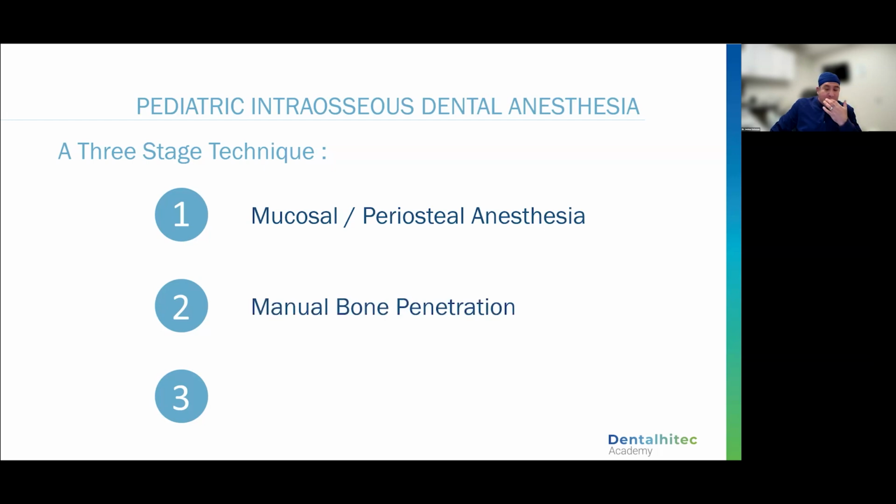Then the second phase, which is what people have to get used to at first. The first time we all gave local anesthesia in dental school, you remember, to an orange, that first pop through the orange was a little dicey for some people, right? I distinctly remember that day in dental school. Trust me, you do it a few times, you'll get used to it. And it's actually now a comforting fact. You're not always going to feel that pop. We'll talk about that later today. But knowing that you pass through that cortical plate, you can feel it. You know that you're most likely into the correct area. And then we're going to give our anesthetic.